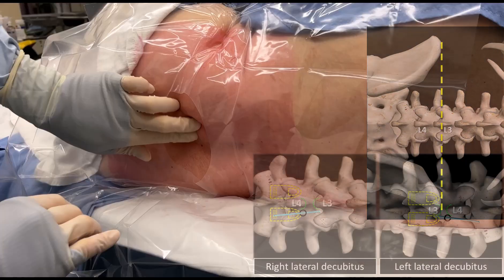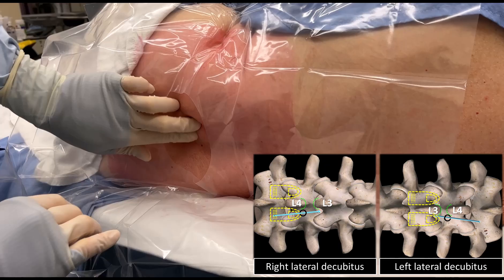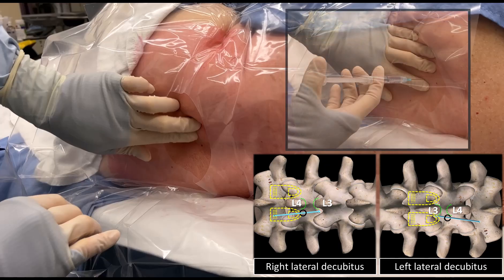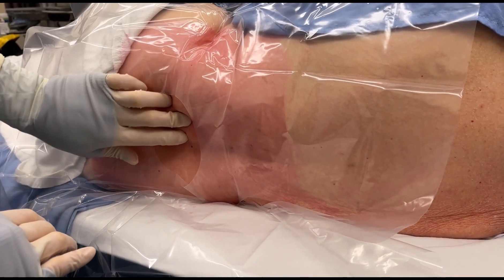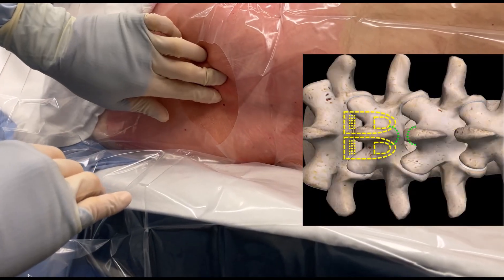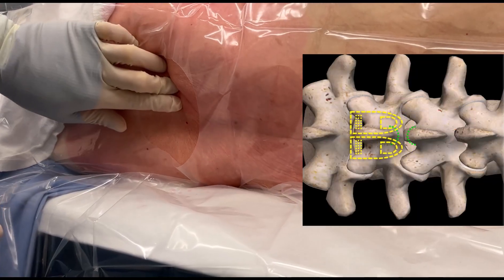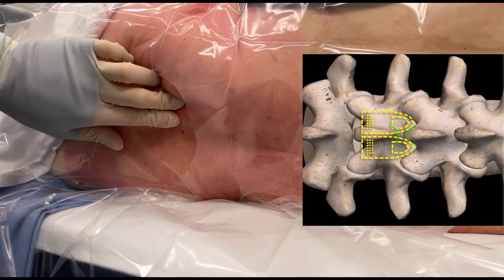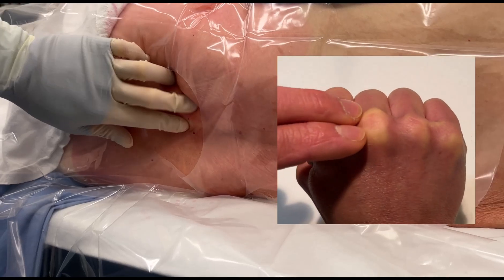Use the index and middle fingers of your non-dominant hand to palpate the line of spinous processes. Right-handed practitioners will use their left index and middle fingers to palpate and fix the skin. Note that in the lateral patient position, the left hand should be rotated so that the fingertips are pointing to the right and thus not obstructing the right hand in later steps. Start by keeping your two fingertips close together and roll them over the peaks representing the tips of the spinous processes and into the intervening valleys of the interspinous spaces.